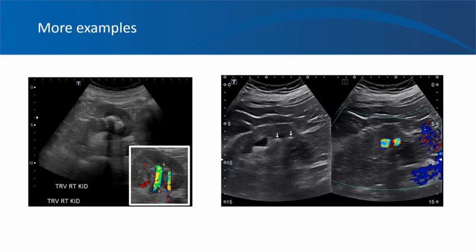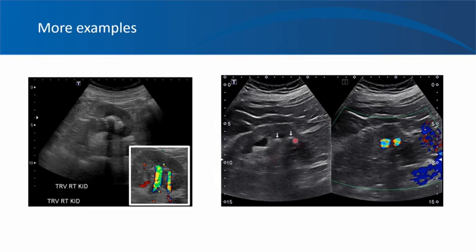Here are some more examples. This is a transverse section of the right kidney showing two hyperechoic structures with shadowing, and when you turn on the color mode, you see nice twinkling with tails. Here is another example of a kidney ultrasound showing two stones in the lower pole of the kidney, appearing as echogenic or hyperechoic structures with some shadowing. When you turn on the color Doppler, you see nice twinkling for both. Note that this one doesn't have tails, but the twinkling is very obvious.